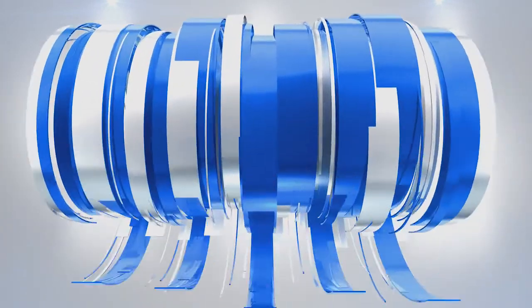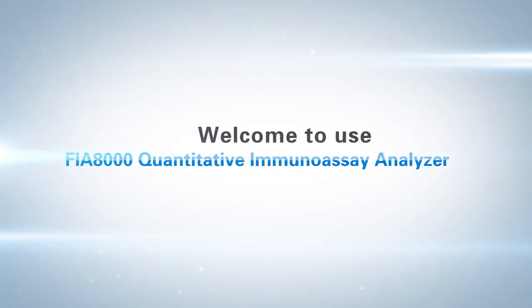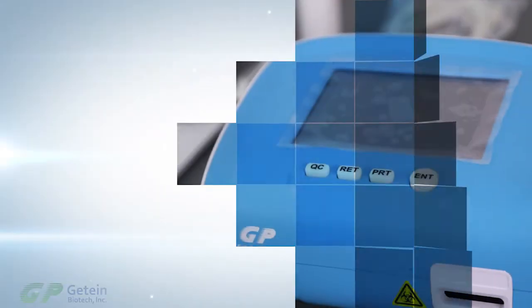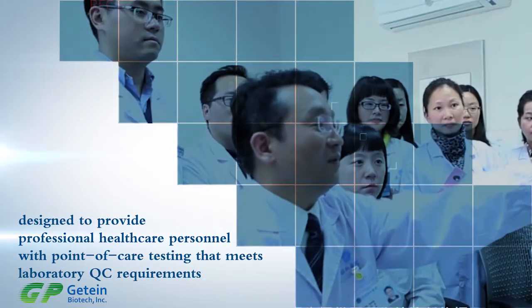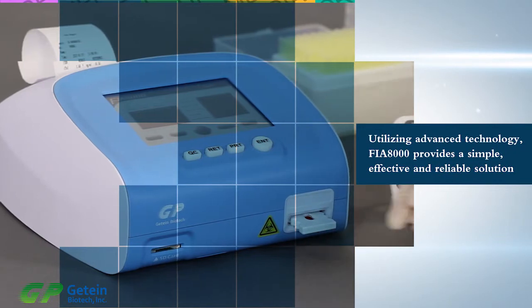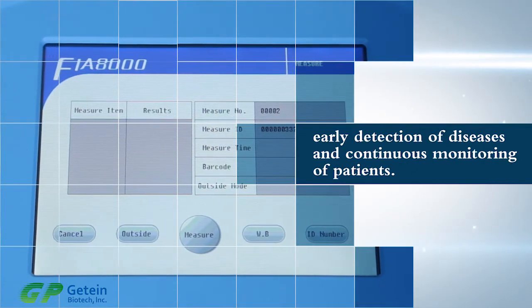Welcome to use the FIA 8000 Quantitative Immunoassay Analyzer. The FIA 8000 is designed to provide professional healthcare personnel with point-of-care testing that meets laboratory QC requirements. Utilizing advanced technology, FIA 8000 provides a simple, effective, and reliable solution to early detection of diseases and continuous monitoring of patients.